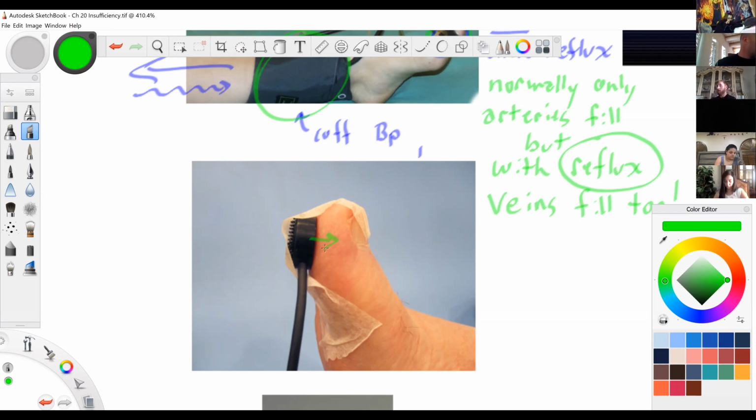All right, well, I'm sure it's in there, but I'm not seeing what it is, infrared light, ultraviolet light, something like that. And it reflects off of red blood cells, and so you have an idea of how much blood is in the toe. Hopefully it's on a thumb. And this is actually similar to a little finger oxygen O2 sensor. It uses the same type of light we have down here.